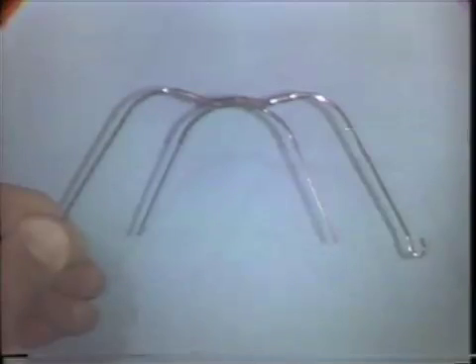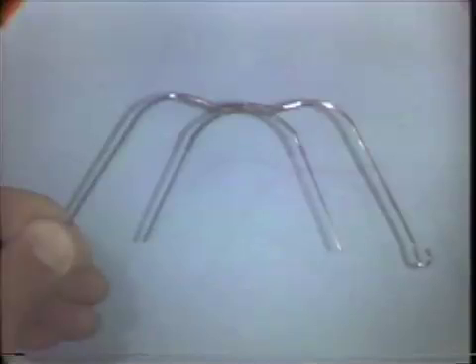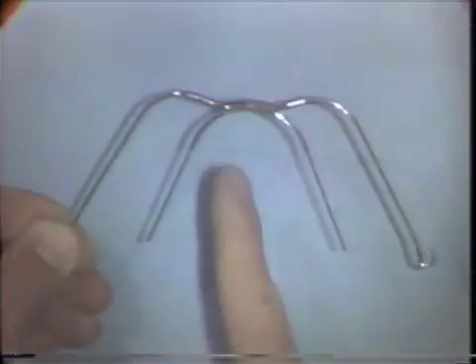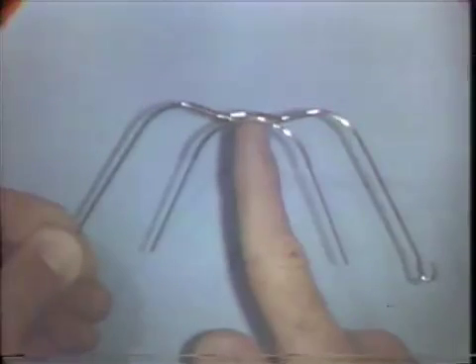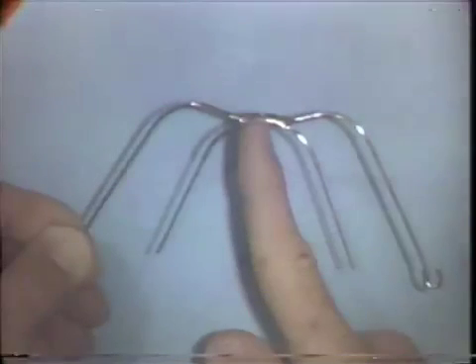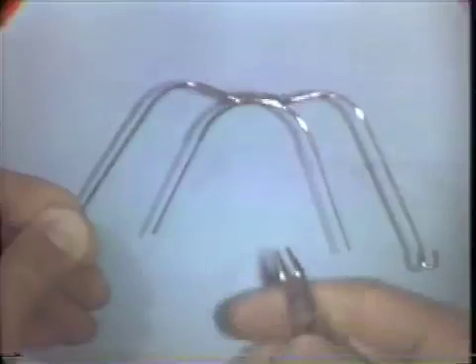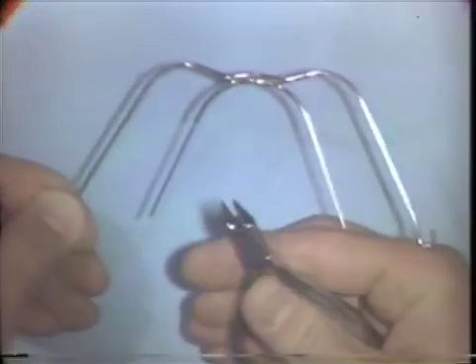The first step in the formation of a Facebow is to place a scratch mark on the solder joint area to indicate the superior aspect of the Facebow. In other words, the side that's going towards the patient's upper lip. 139 bird beak pliers are used to adapt a Facebow.